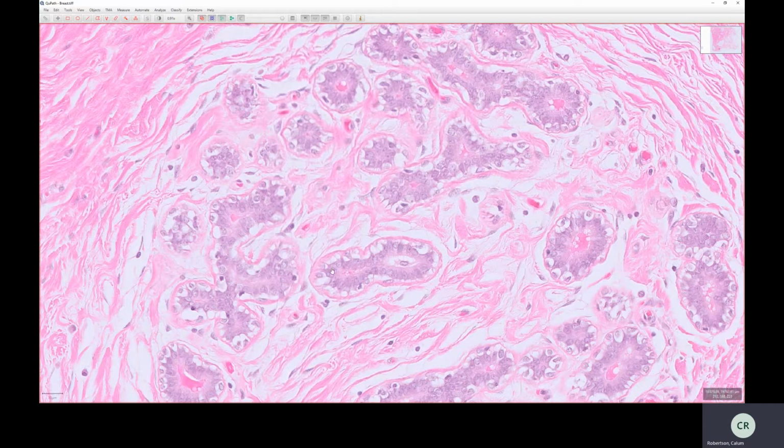But beneath that single layer of epithelium, we've got another layer, so it's bilayered, and that's these cells which have abundant clear cytoplasm. And that's a nucleus. This is the cytoplasm of that cell. If we follow that round, there's another nucleus with lots of abundant pale cytoplasm, another nucleus. And these are the myoepithelial cells which surround the epithelium on the outside. So two layers, myoepithelial, because they have contractile ability, and the epithelial inner layer. So that's the bilayer.